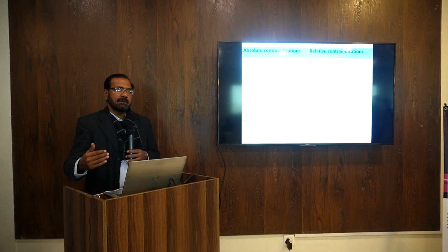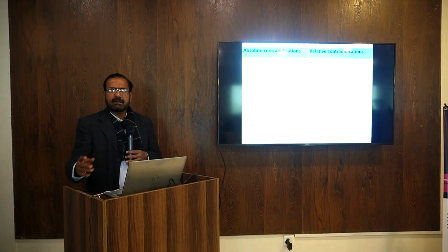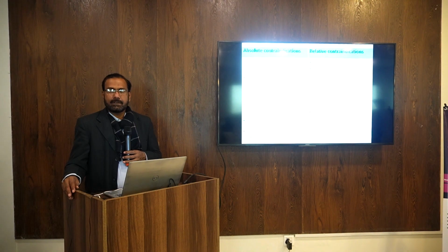Suspicion ki yahan arterial hogi to main wahan usko cannulate kar lungi ya main needle dal ke ghar dalne ki koshish karun. That should not be attempted actually. Aur iske sath kafi sari jo hai wo complications reported hai.